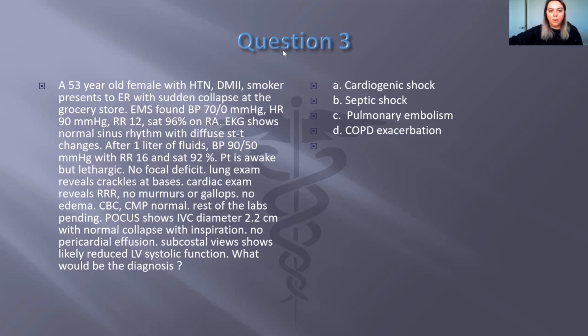I think we just had one more question come in. If you don't have B lines in a lung ultrasound, can you rule out pulmonary edema? I don't think so, because B lines are helpful when you see them, but it doesn't mean that there is no pulmonary edema.